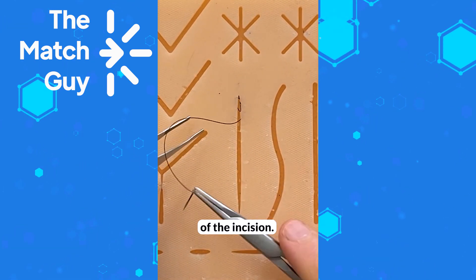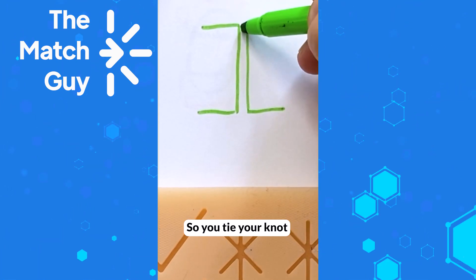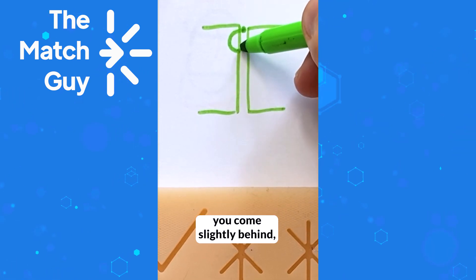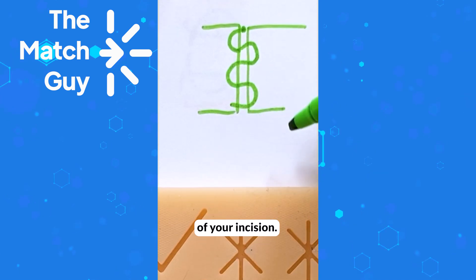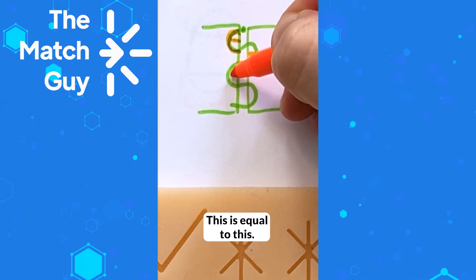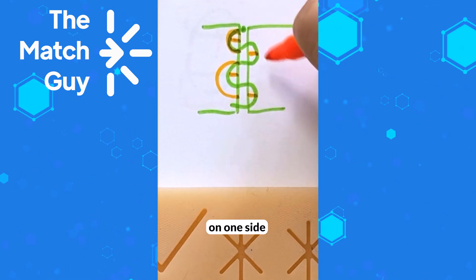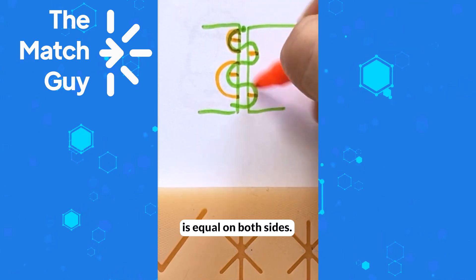Pull and keep doing that until you reach the end of the incision. Imagine this is your incision — one side and the other. You tie your knot and then start running: back and forth until you reach the end. Make sure the pass is parallel to the surface of the skin without going through it, and make sure that the bite on one side is equal to the bite on the other — so you don't go deeper on one side and more superficial on the other. Keep the bites equal on both sides.